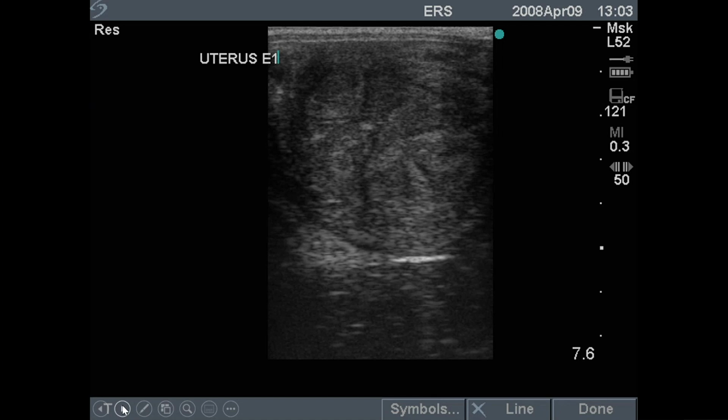Our system is, we used a numbering system, so 0, 1. And this is what we would call endometrial score 1, E1. Now, you might call it something else. It does not matter, because it's a relative diagnosis. So whether you call it a 1 or call it a 2, it doesn't matter, as long as it's relative to you. You're looking for the increase and decrease.